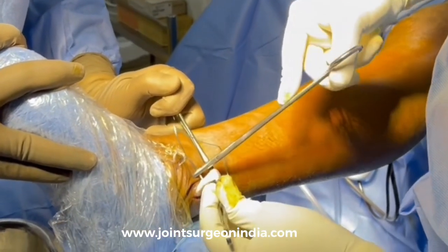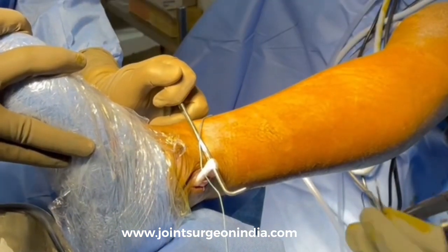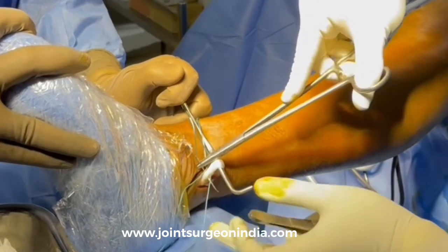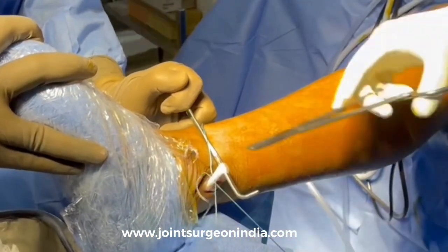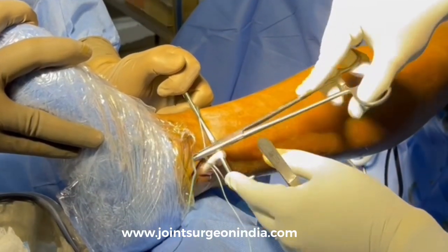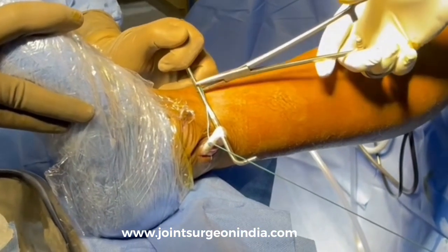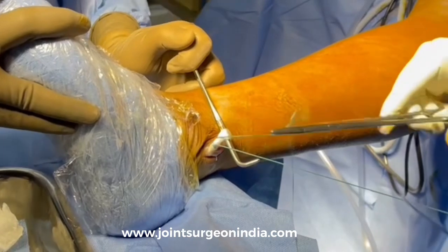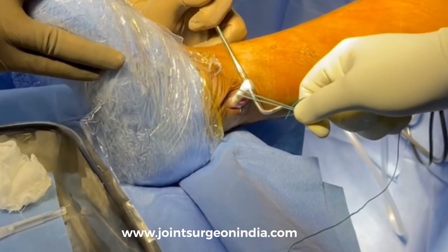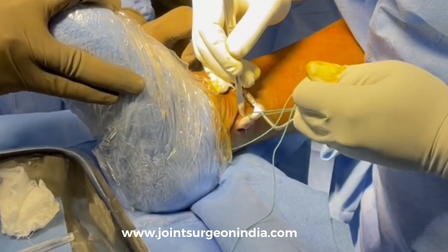Ethibond sutures are then passed through the distal stump of the Peroneus longus tendon, which allows us to pull it further and detach it as close to its insertion as possible. It is really not required to suture back the distal remnant of the Peroneus longus tendon.